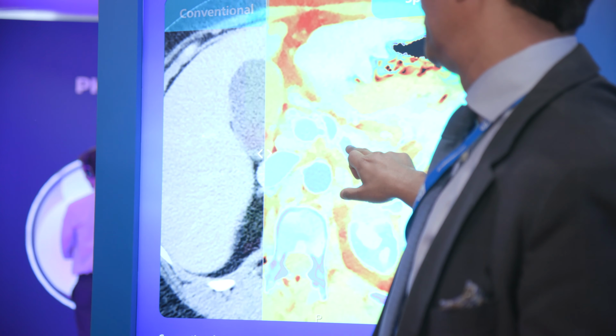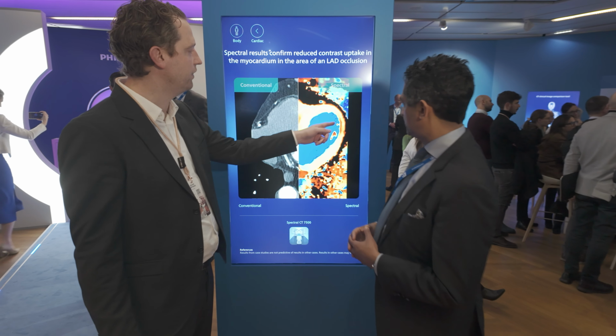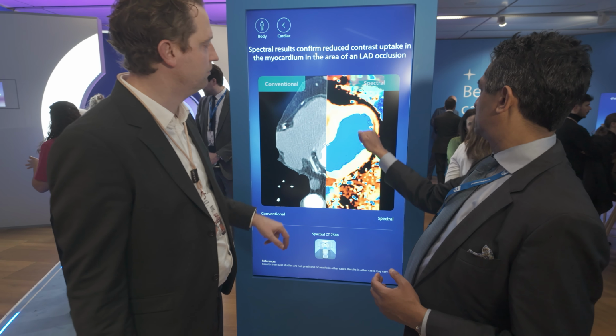With the power of spectral CT, we get, for example, iodine maps for free, and we can look for enhancing lesions in the myocardium. Therefore it is even possible to look for differential diagnoses like myocarditis, for example, in patients with a troponin-positive chest pain, or we can also look for acute myocardial infarction in these patients despite the coronary arteries being normal, and this is typically referred to as MINOCA syndrome. MINOCA, microvascular disease. Yep.